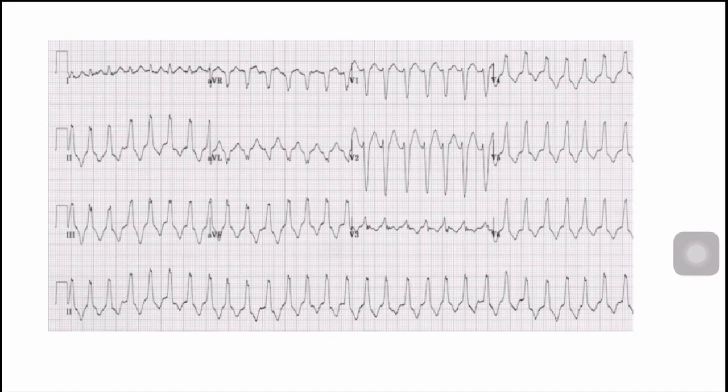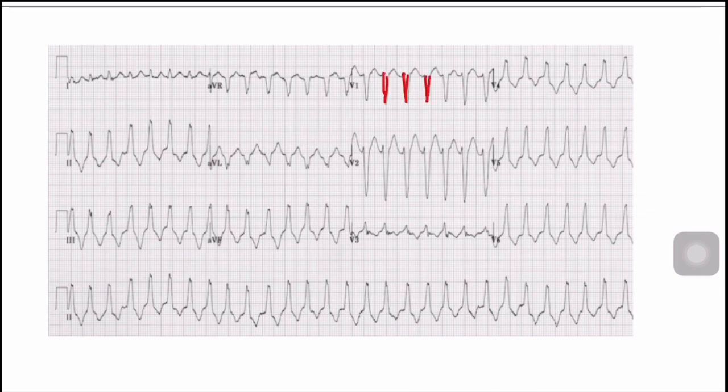This ECG shows ventricular tachycardia — a wide complex tachycardia that is regular and without P waves, so it is ventricular tachycardia until proven otherwise. The morphology is LBBB: in V1, the QRS complexes are downward, indicating left bundle branch morphology. Any VT with left bundle branch morphology in a young patient presenting with syncope — always suspect ARVD.